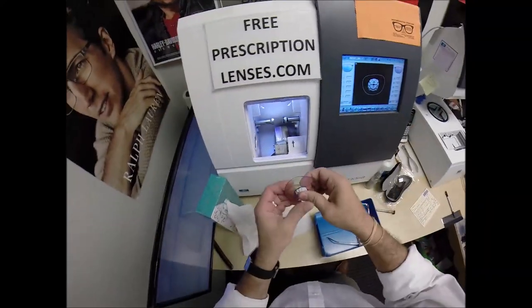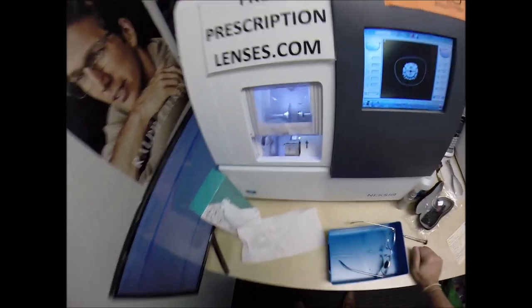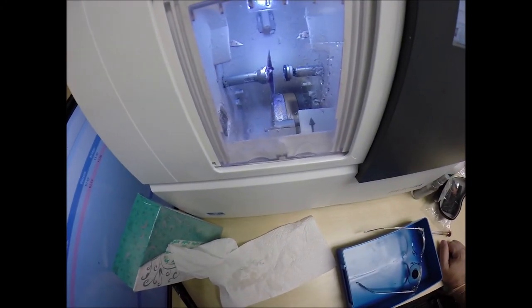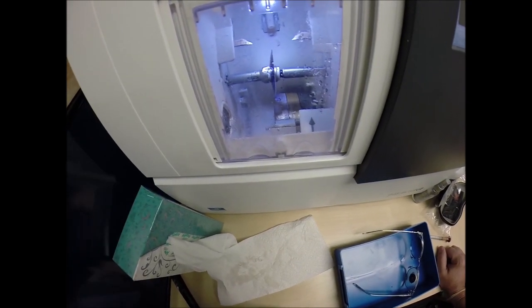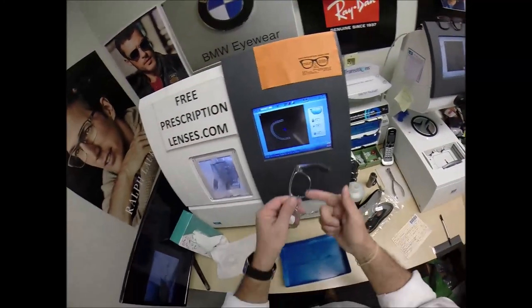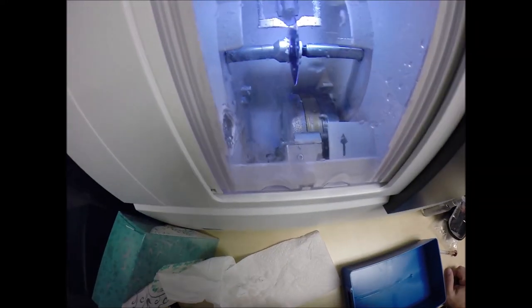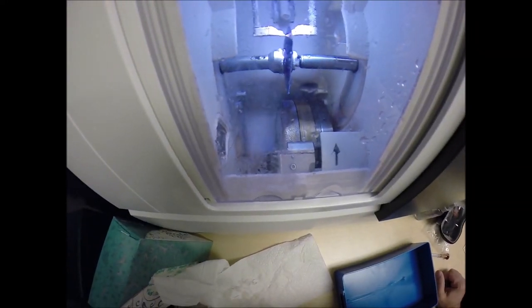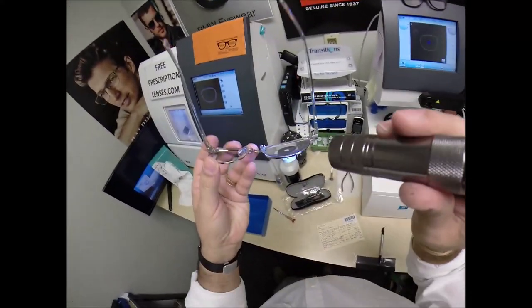Now let's go ahead and start cutting the left lens. Press that on there firmly and hit start. The door closes, the clamp shuts. Just like before, the lens will be traced by two white styluses, making sure it's large enough to fit into the left side of the frame — and then measure twice, cut once, knowing where to place the bevel for the best cosmetic look possible.